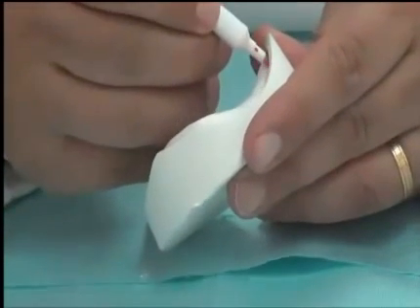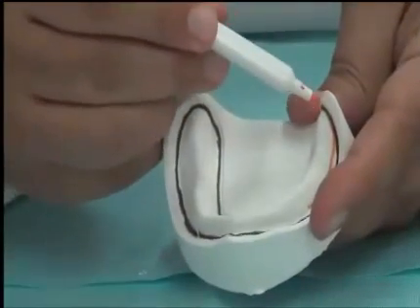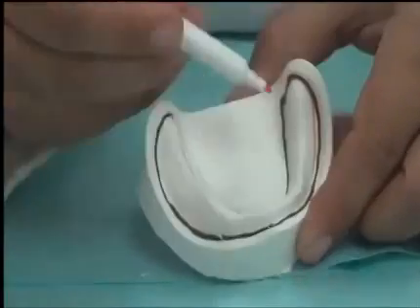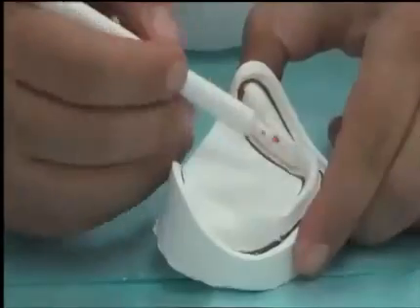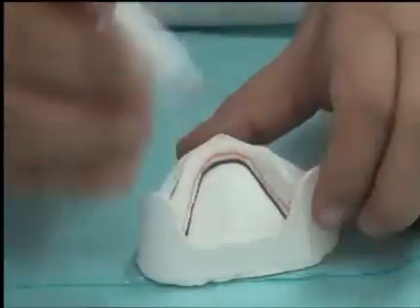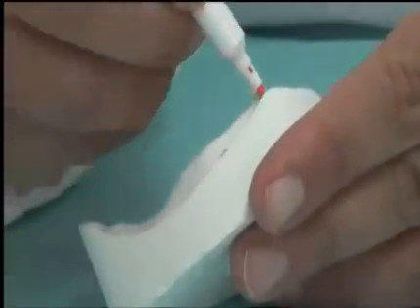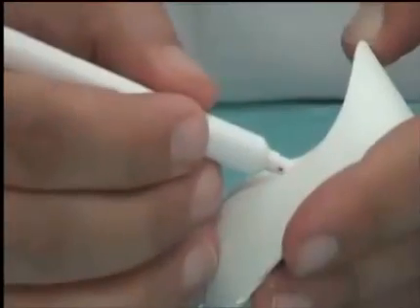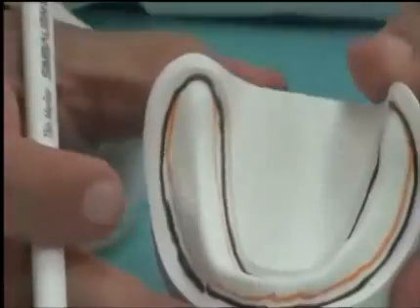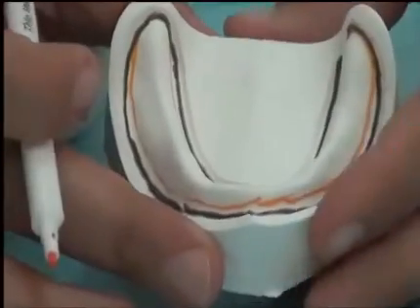But once we reach the posterior edge, as we said, the two lines meet. So posteriorly, the two lines meet. Now I'm going to draw on the lingual line. For the lower tray, we will make it a full coverage tray with no spacer.